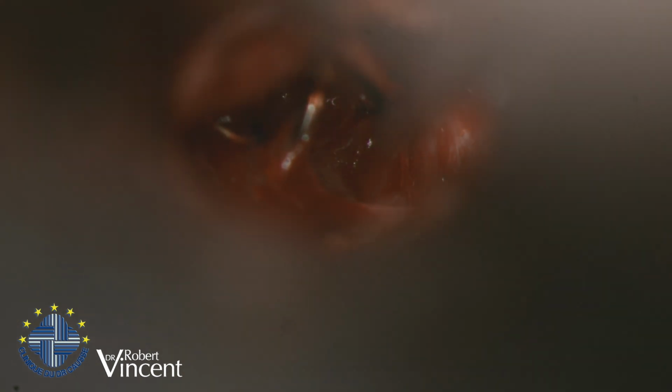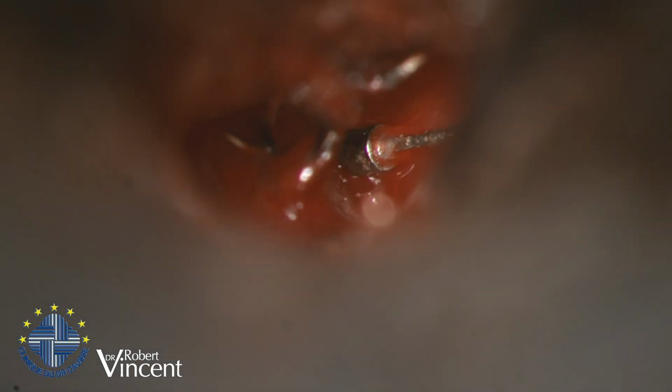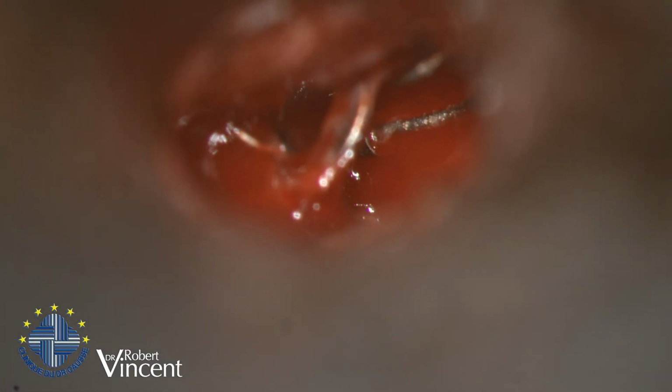We have the fallopian canal right here. Okay, so we need to now dissect it. Table en avant, s'il vous plaît. Stop. I did a little bit of a canalplasty, mainly at the anterior part of the canal.